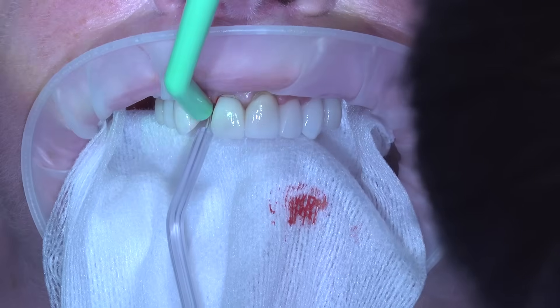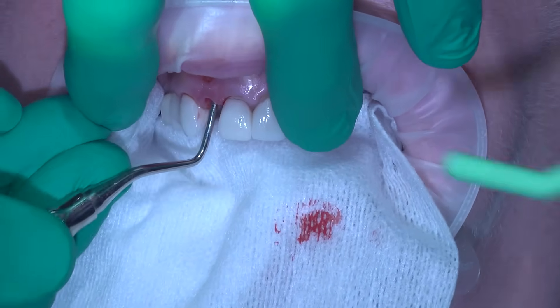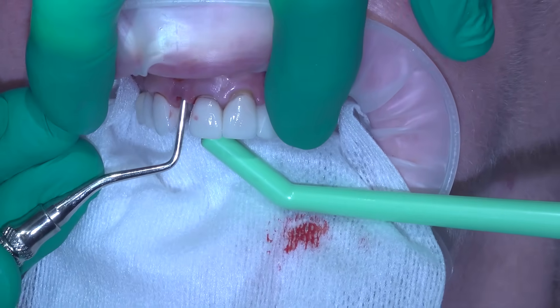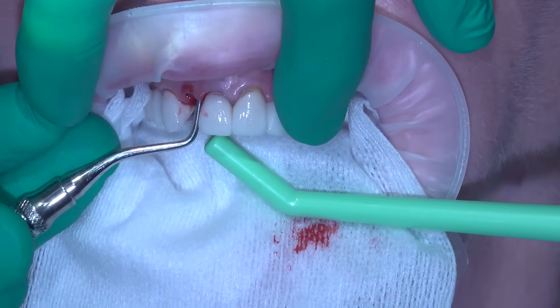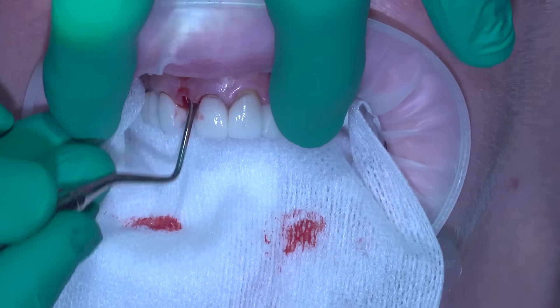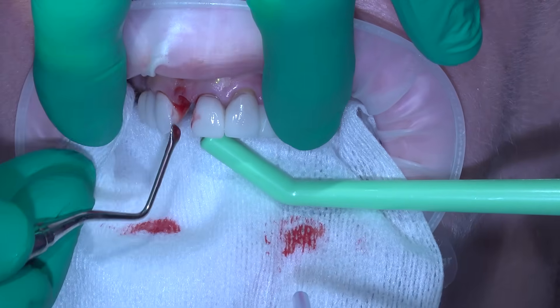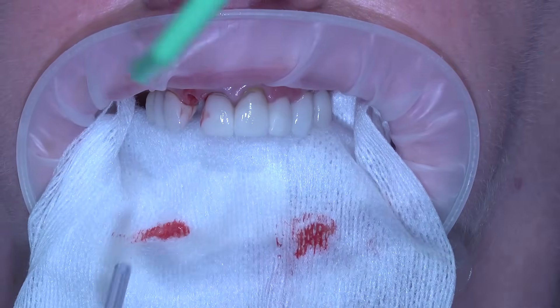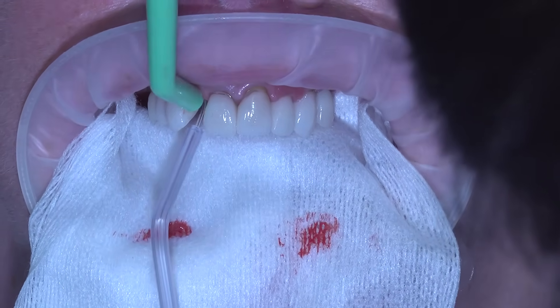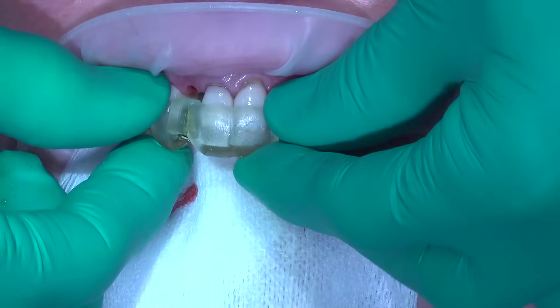We're going to irrigate, and then follow up with our serrated curette from Hu-Friedy. If you don't have one of these serrated curettes, buy yourself one — it can get out granulation tissue like it's supposed to. I want to make sure we really scratch the lamina dura of the extraction socket, because when you take a tooth out, if you don't get bleeding, you're not getting the first step to healing. All the infection is verified as gone, copious irrigation, and we are also assessing the buccal wall — making sure it's intact, and in this case it is.